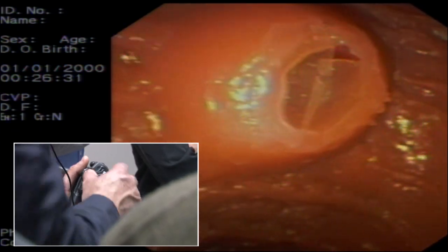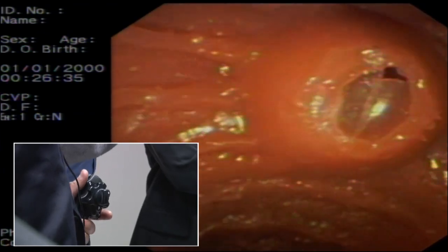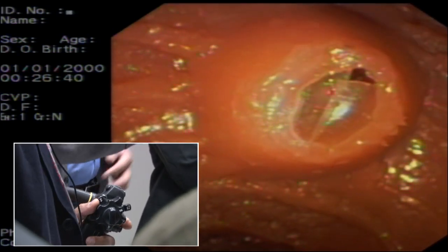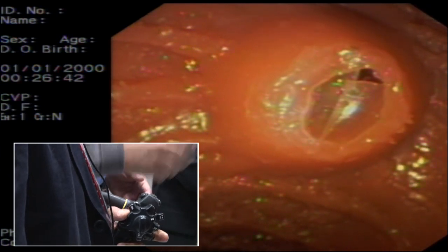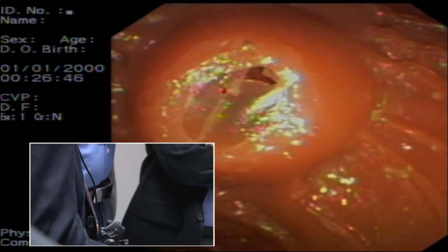Where they come from, you don't have any scopes that are more than 2 years old, right? Most of the centers I know have a 1-year contract, and every year they get new ones. I know Mass General changes everything every year. At the end of the year, the scope gets replaced. They have many scopes and no issues.